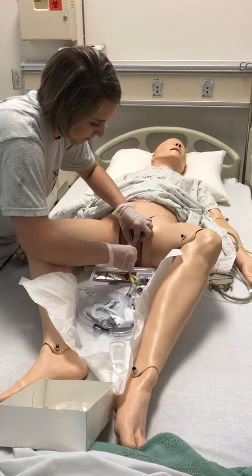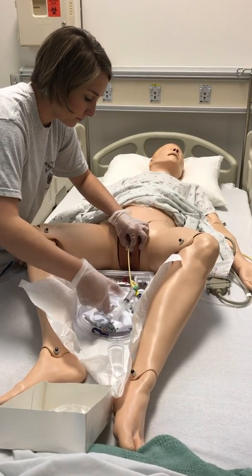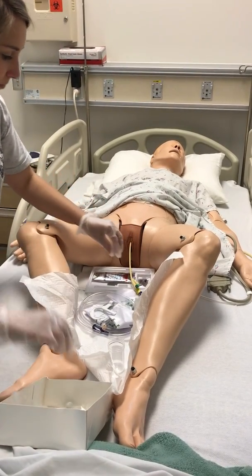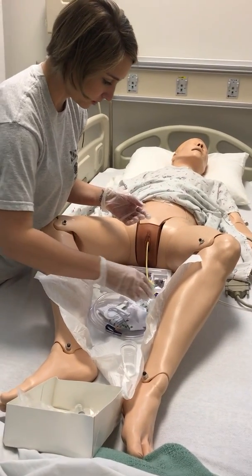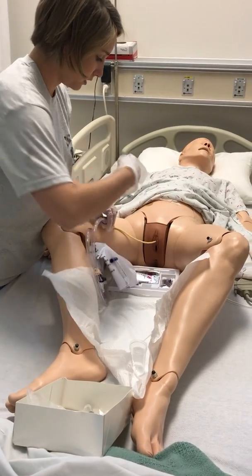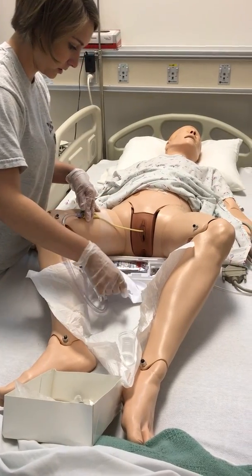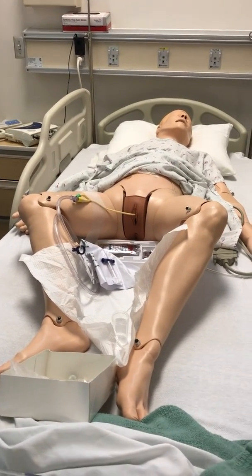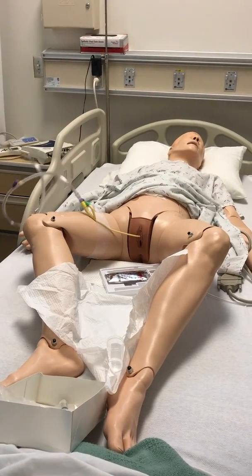Very good. I'm going to blow up the catheter because there's some residual. I'm going to tug gently. Very good — it's in place. I'm going to take and attach this to your leg. There we go. I'm going to remove my gloves. I'm going to attach this to the bed line.